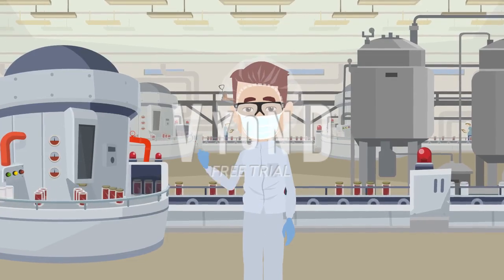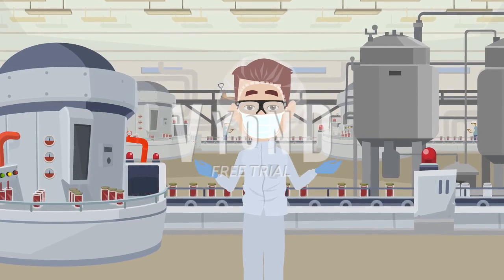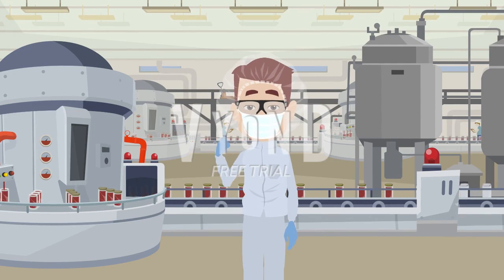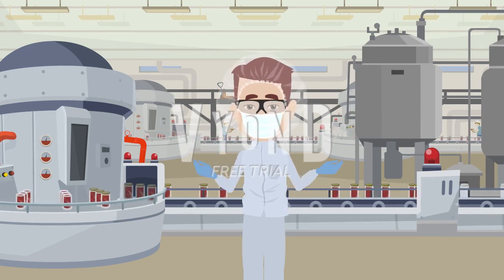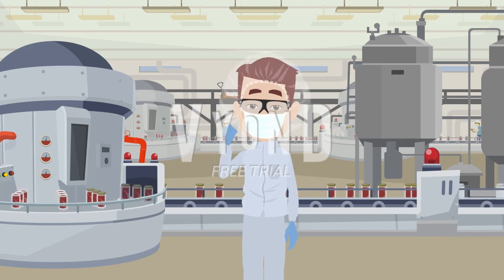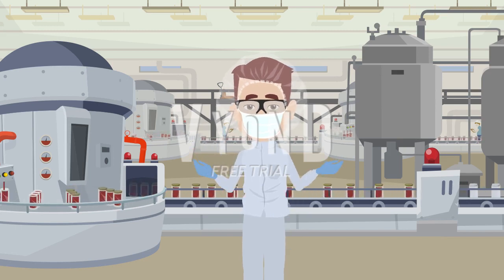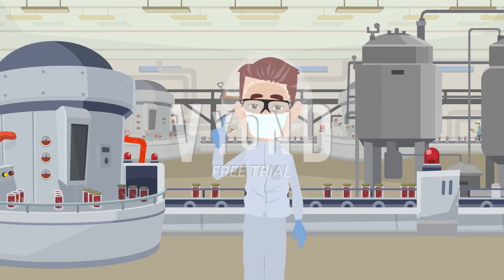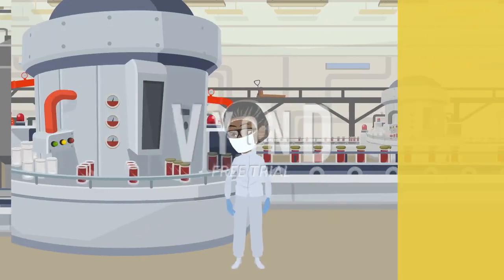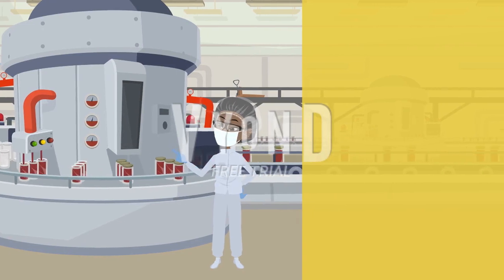The first method is what's called the direct inoculation method. This technique involves the aseptic transfer of a sample drawn from the test product solution into a medium specifically intended for sterility testing. Before employing this method, it's essential to confirm the test product solution itself does not suppress the growth of standard microorganisms. Another method is the membrane filtration method.